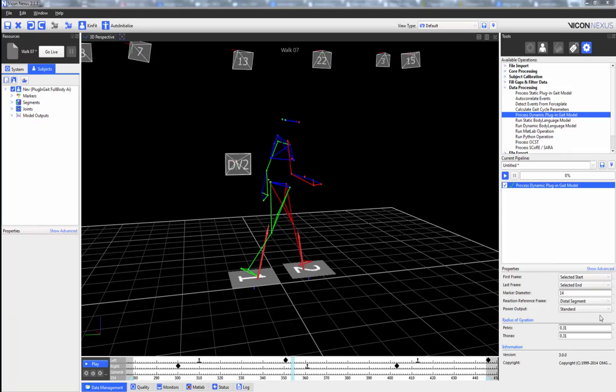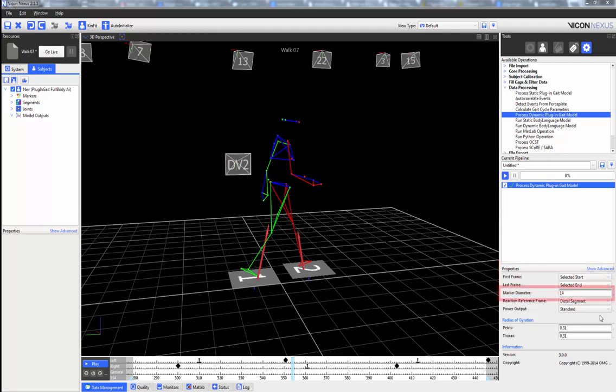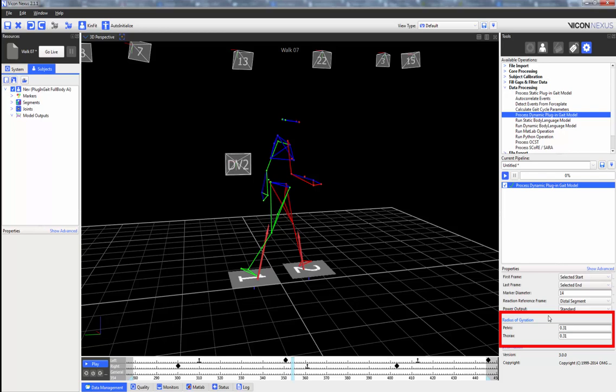After the dynamic trial has been captured, the trial has been labelled correctly, all gaps have been filled, and any other pipeline operations such as filtering have been run, the Process Dynamic Plug-in Gait Model can be run. The properties we can adjust are the first and last frame, the marker diameter in millimetres, whether the reaction reference frame applies to the proximal segment, the distal segment, or the global frame, and we can also adjust the radius of gyration of the pelvis and the thorax.